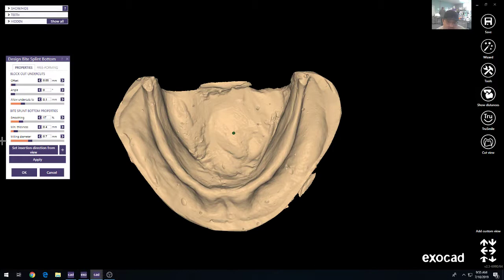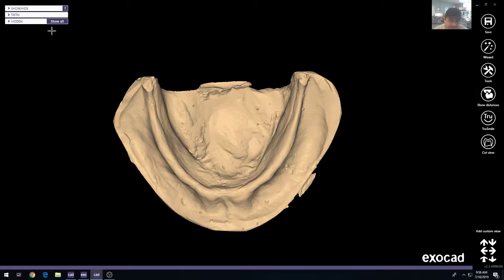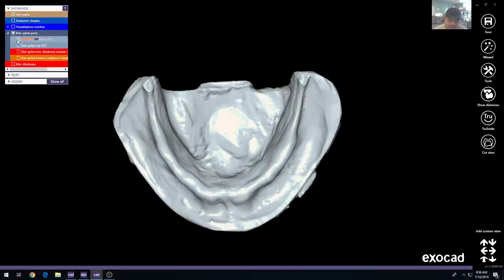So we'll leave the settings like this. Everyone will kind of come up with their own settings. You can allow the undercuts up to a certain amount. This is then basically the smoothing properties and milling properties for the Bitesplint. So you'll just go ahead and press apply and what that'll do is create a layer called the Bitesplint bottom.